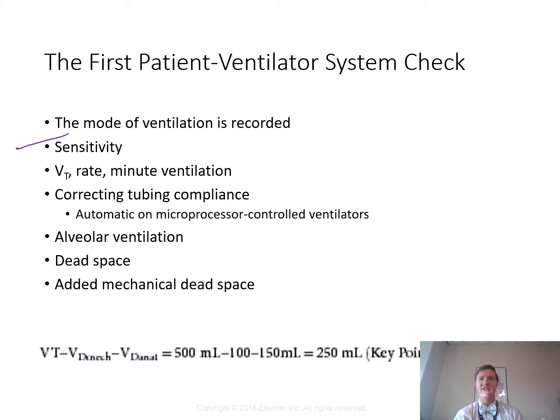If the vent is checked and we see auto triggering, where it's cycling a breath, cycling a breath, cycling a breath, and it's too sensitive, then we can adjust that as needed, where we can make it harder for that breath to be triggered and therefore avoid hyperventilating the patient mechanically. So we can always make adjustments as needed. When there's auto PEEP present, we can make adjustments as needed because they might have difficulty triggering the breath, so we might have to make it more sensitive for those auto PEEP patients, right?